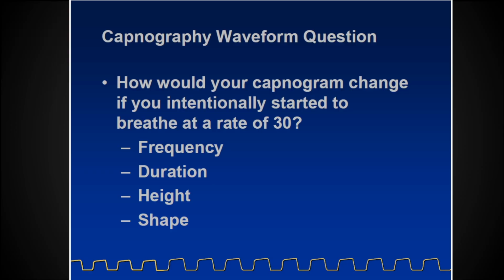and your end tidal would drop. Is a person who is in DKA acidic or alkalotic? Acidic. How is it possible that they're acidic if their end tidal is low? Because they're breathing off all the CO2. So if you only associate acidosis with end tidal, you might say, oh, this DKA guy, he's at 25 capnography, so he's probably alkalotic. And it is like, no, he's definitely acidic. The lactic acid is building up so fast, because that's a metabolic issue. That's right.